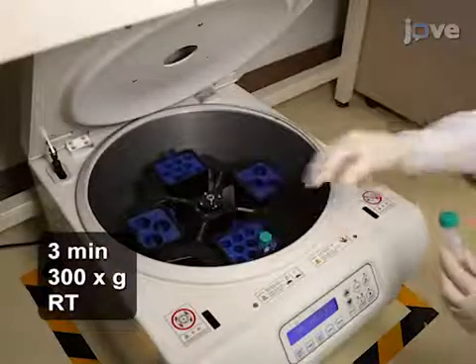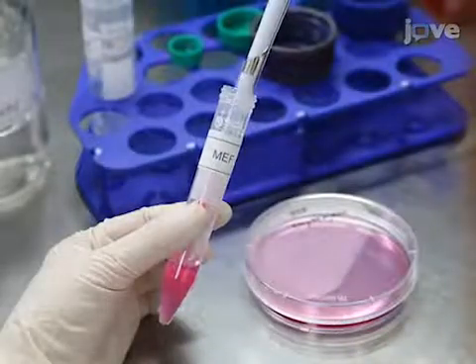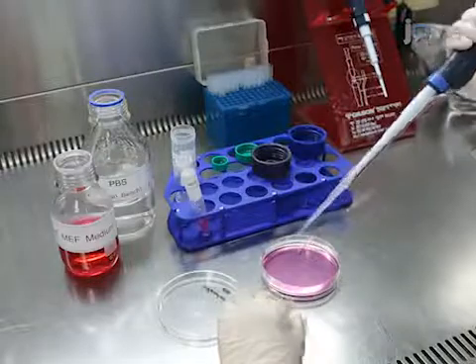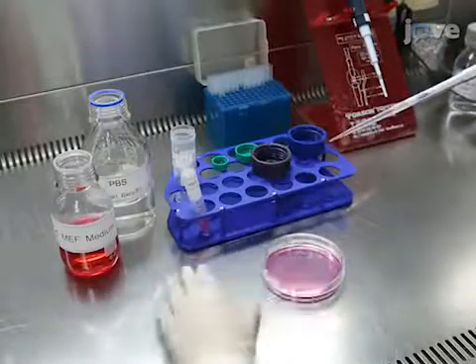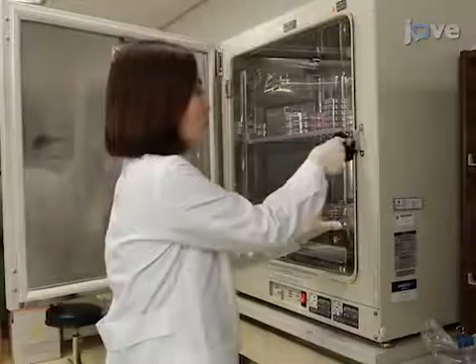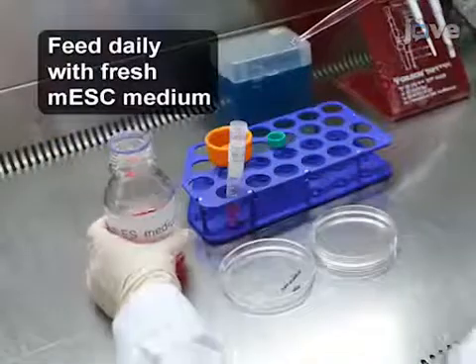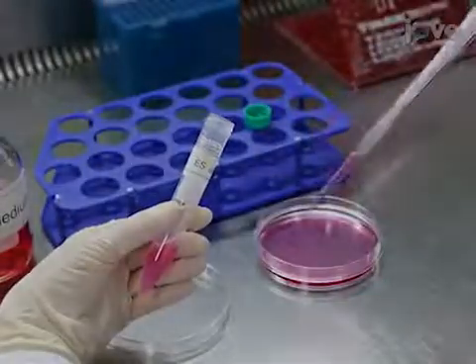After collecting the cells by centrifugation, resuspend the pellet in 5 milliliters of MEF medium and plate 2 times 10 to the 6 inactivated MEFs per 10-centimeter culture dish in fresh MEF medium. Culture the feeder cells for 24 hours. Then replace the MEF medium with mouse embryonic stem cell medium and seed 2 times 10 to the 6 mouse embryonic stem cells.